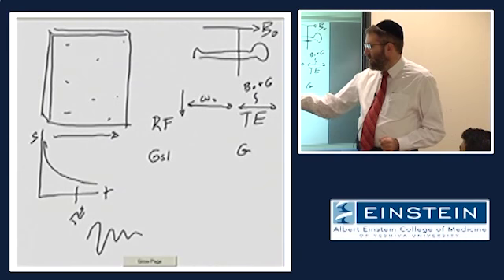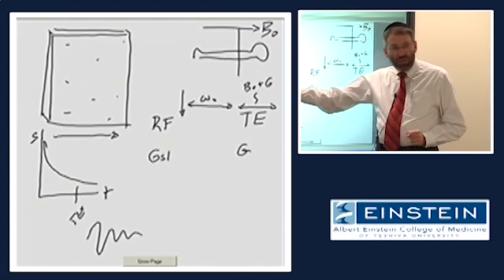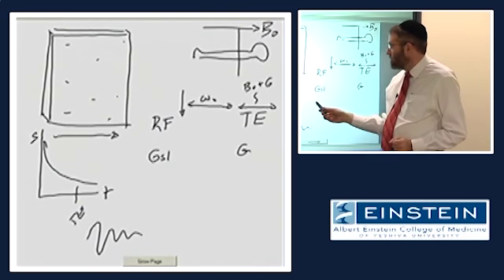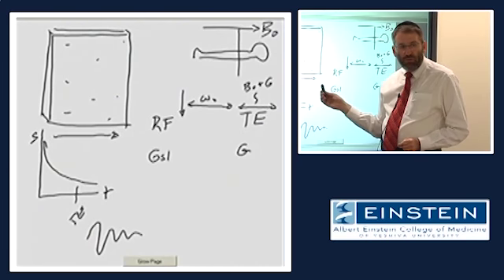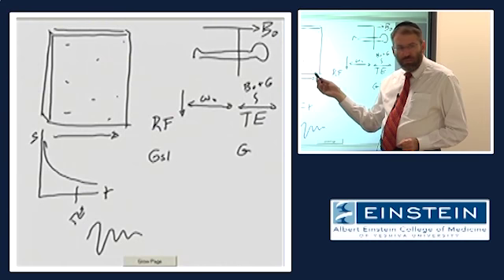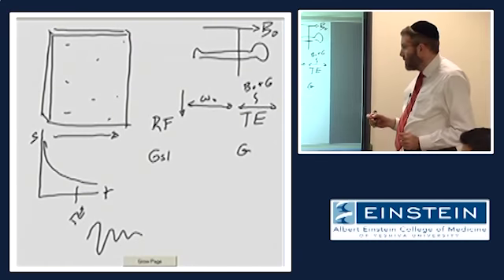And the amount of gradient magnetic field experienced by those spins depends on their location, left to right in the image. So spins farther to the left might be precessing slower than spins farther to the right. Not only that, but there is a linear progression of frequency across this dimension.